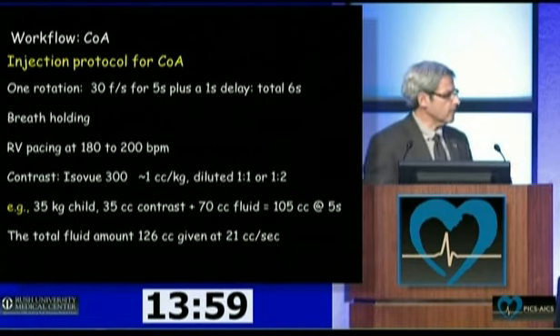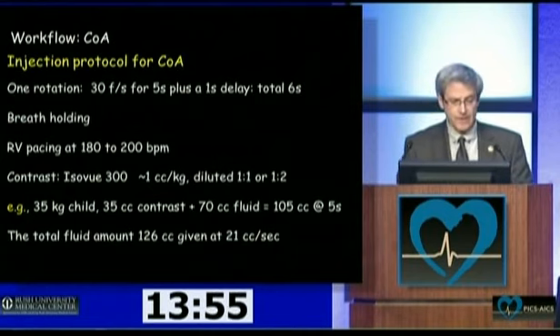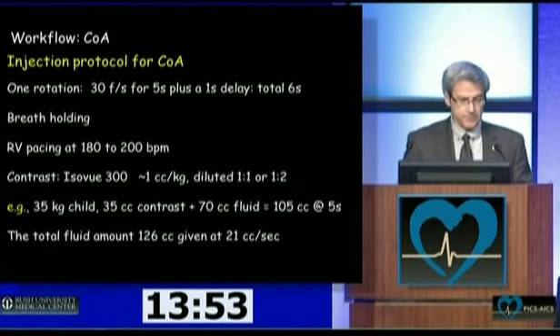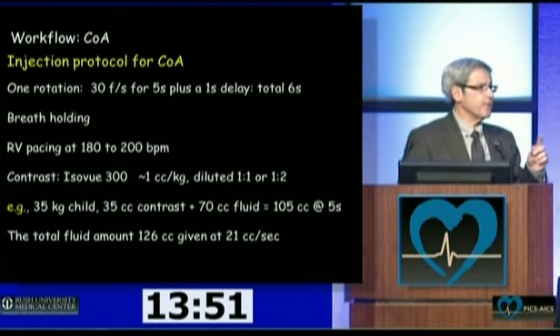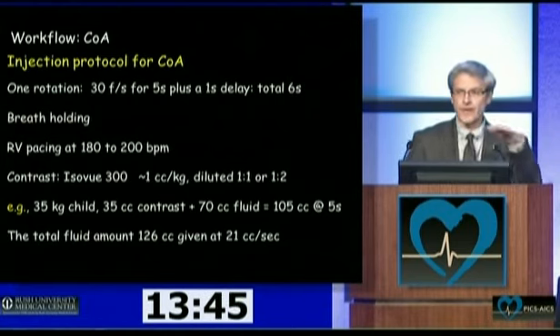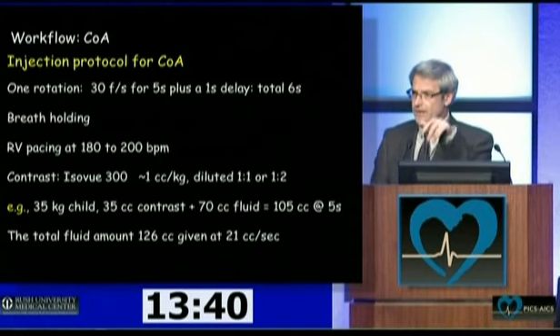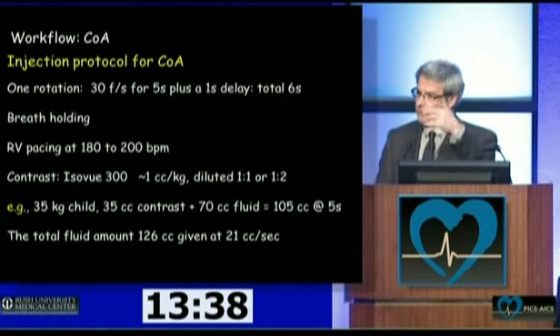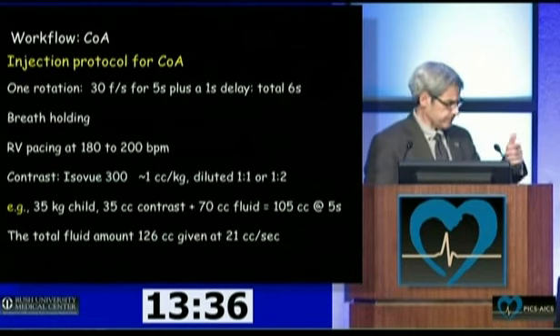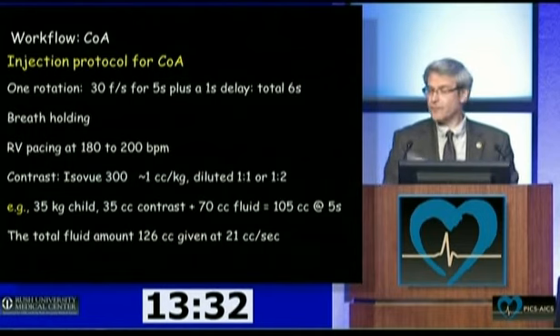We do a breath hold, our patients are anesthetized, and we pace the RV for coarctations at 180 to 200 beats per minute. We use Isovue 300, so the iodine content of our solution is perhaps a little different from what you use. You have to factor that in when you define your acquisition, because it's dilutional, it's not full contrast.